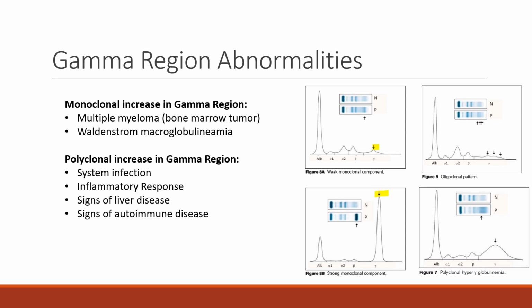Those can indicate certain things like multiple myeloma, which we know is a bone marrow tumor, or this other type of disease.